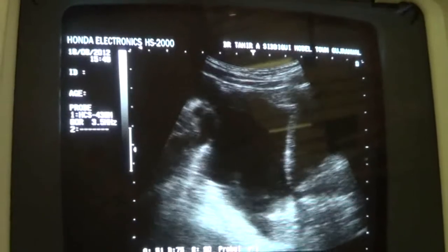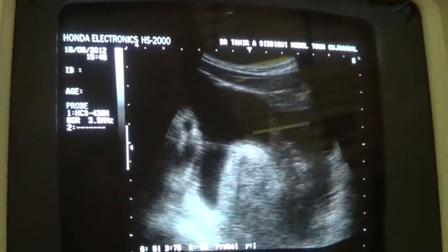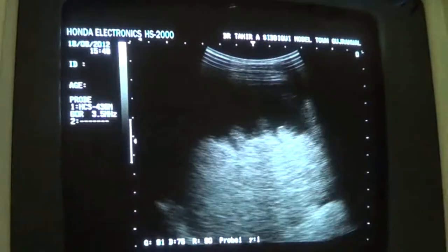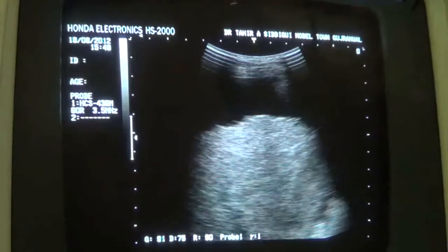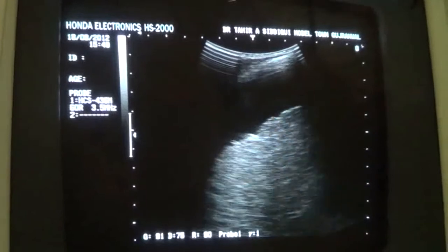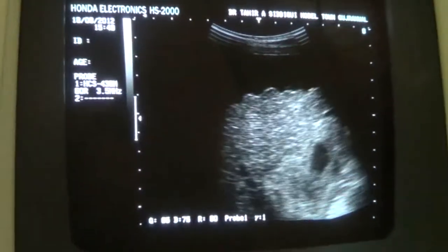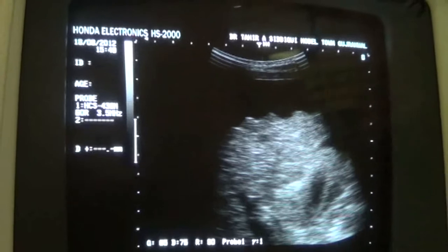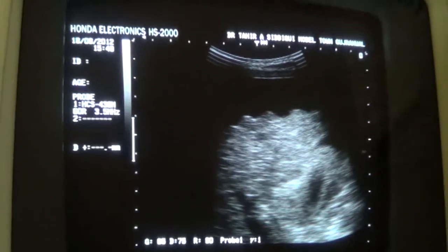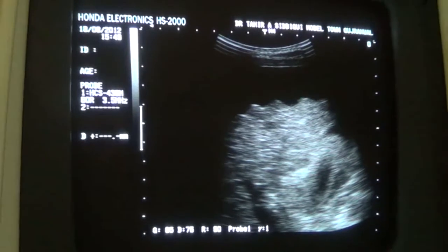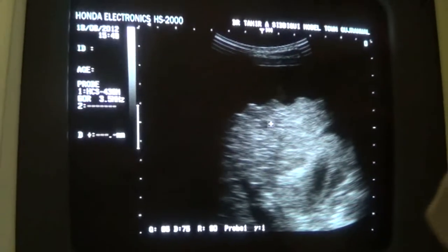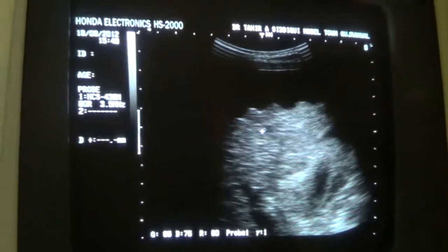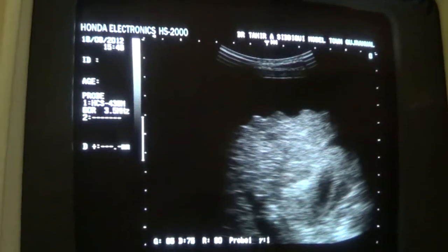So this is the patient — a shrunken cirrhotic liver with cirrhosis and ascites. The liver is also showing macronodularity. There are some tiny hypoechoic areas seen within this liver — about eight to nine tiny hypoechoic areas, possibly regenerating nodules within this cirrhotic liver.